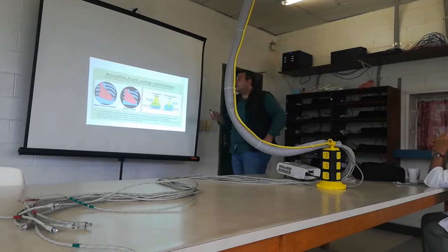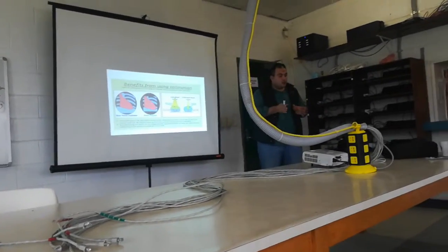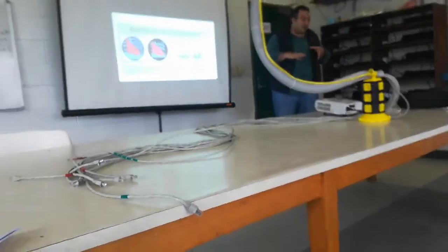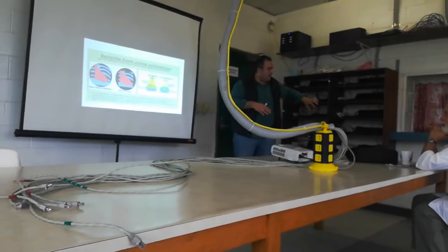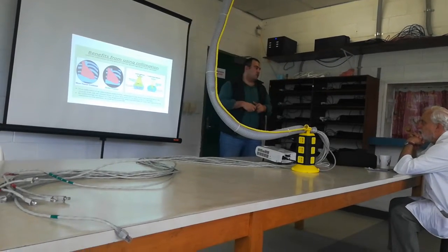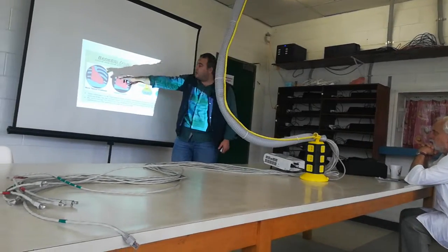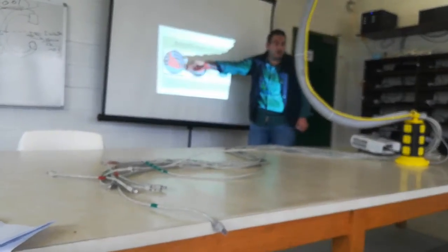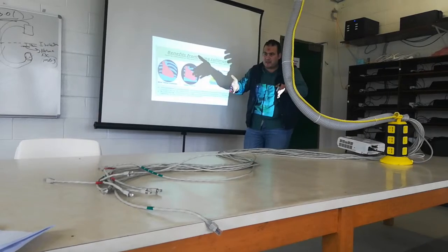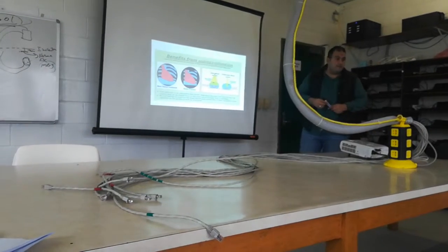There is another parameter, which is collimation. There is a difference between field of view and collimation. Magnification is one thing, and collimation is for reducing the dose to the patient. If you expose all this area of the patient, there is no need to expose this region from the heart, from the lung. So you have to collimate the beam to prevent the radiation from being incident on this region. Now you decrease the dose to the patient.